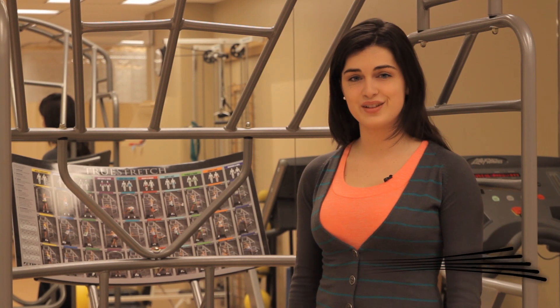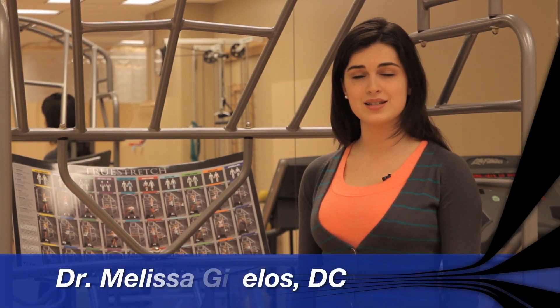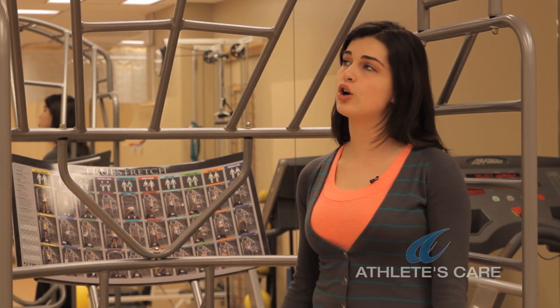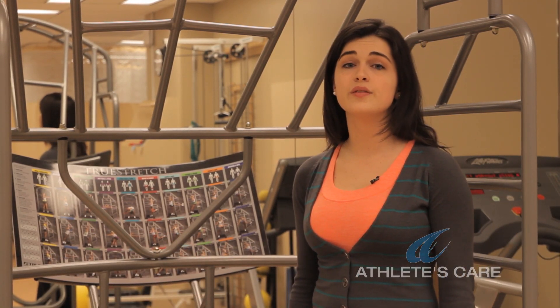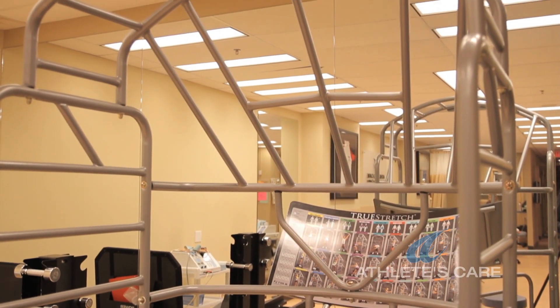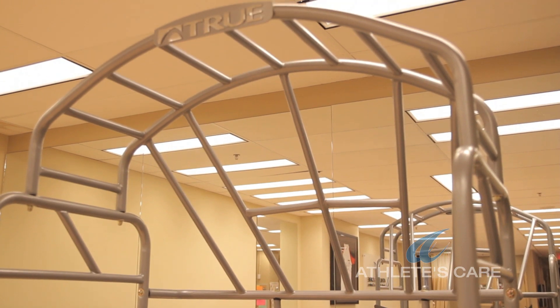Hi, I'm Dr. Melissa Givalis and I'm here at Athletes Care Sports Medicine Centre with registered physiotherapist Laura Longo, who will be joining us to show us how to use a piece of equipment called the True Stretch. The True Stretch is a functional piece of equipment developed by Gary Gray, which allows you to stretch in all planes of motion in a controlled environment.